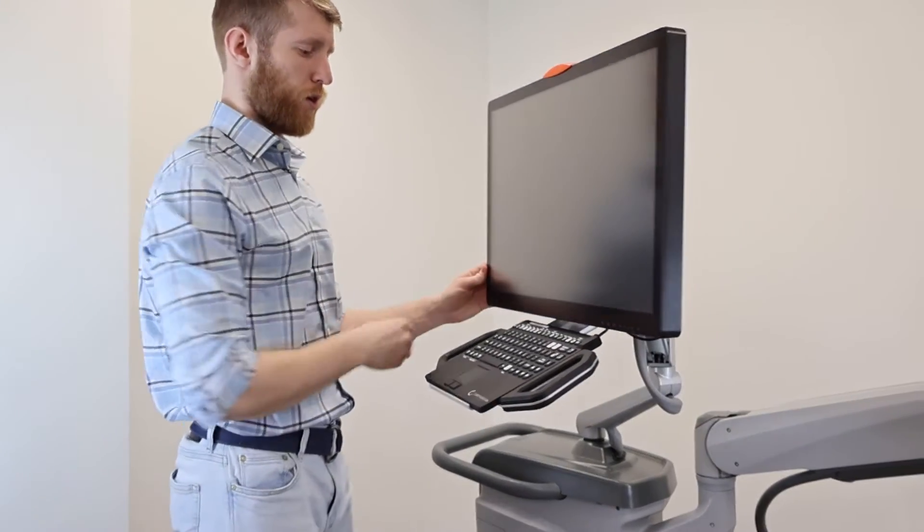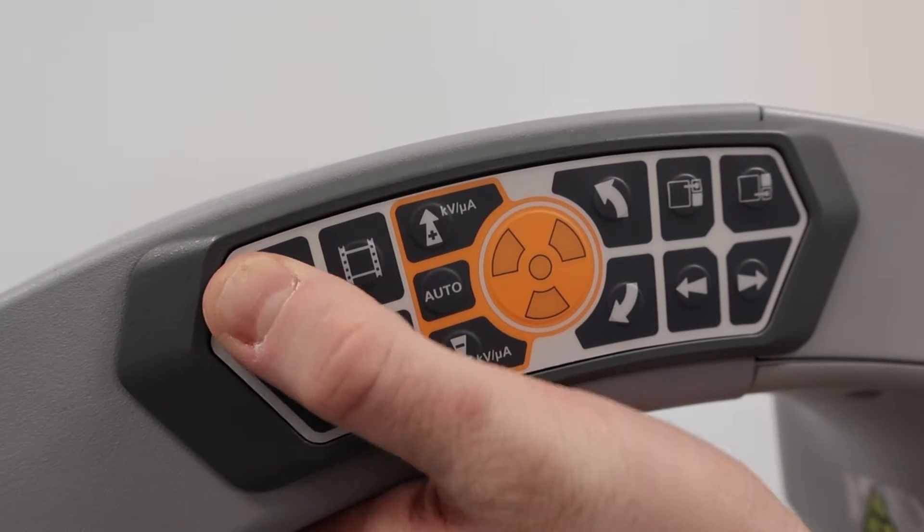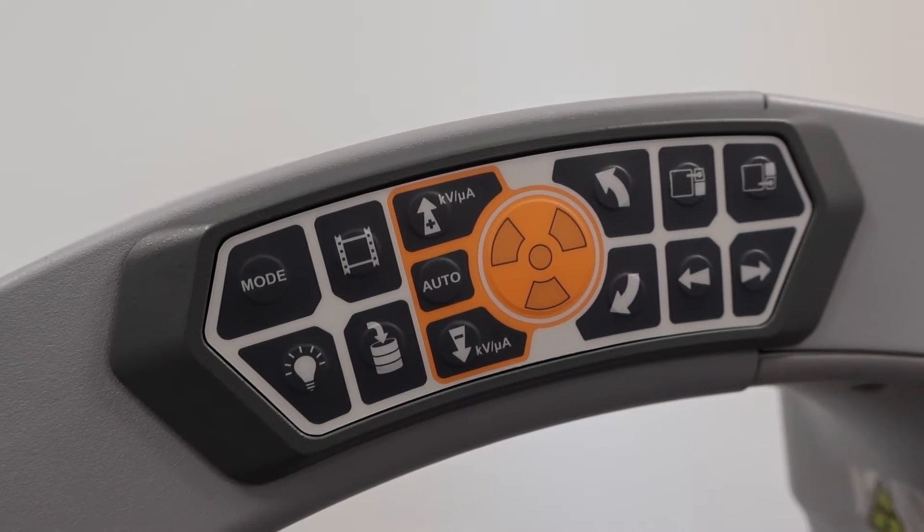It can be adjusted to different heights and positions to fit the clinician's needs. The Tau 2020 has additional bilateral backlit controls on the C-Arm.